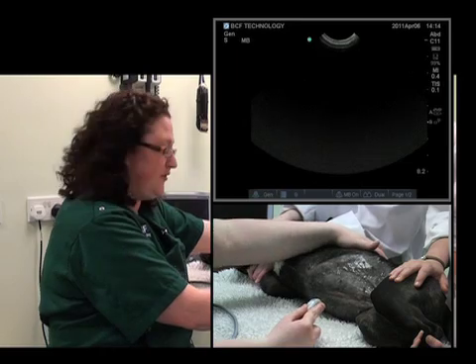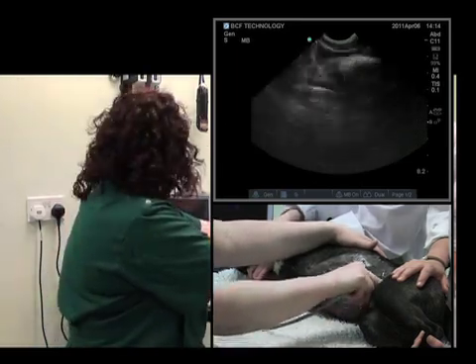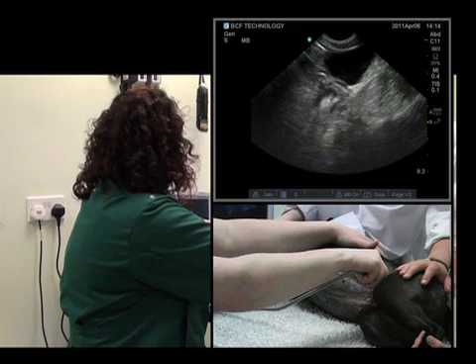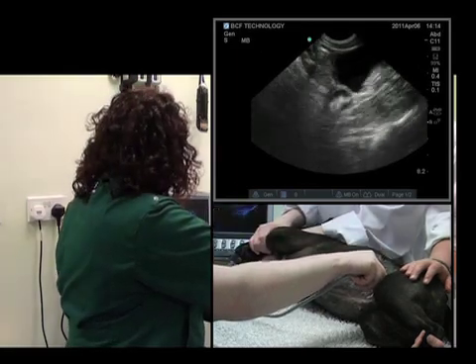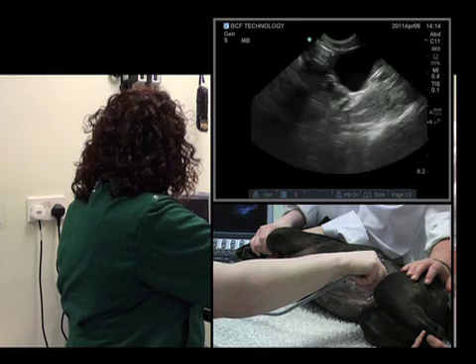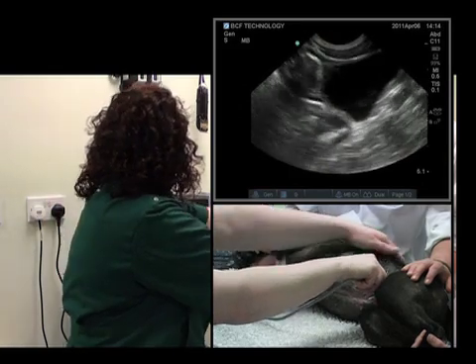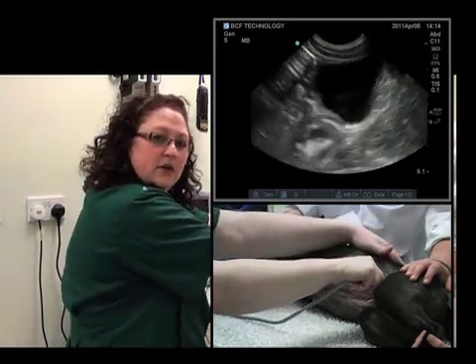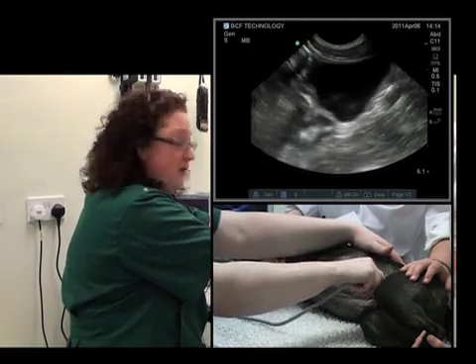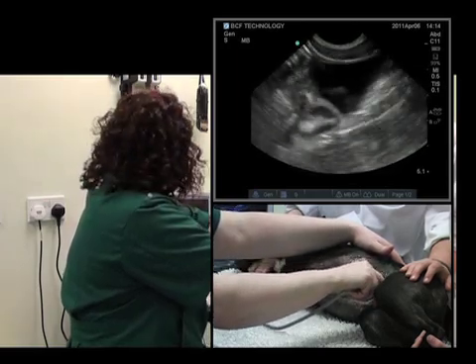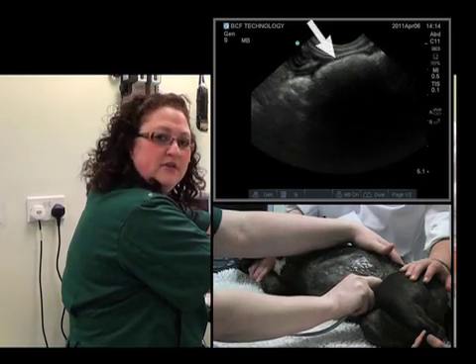Once we get to the caudal abdomen, we can stop at the bladder, which we've seen previously — there it is at the top of the screen. We'll need to change depth just now. The colon is located just dorsally to the bladder, so we can actually fan up and see the colon as it starts to come into view.